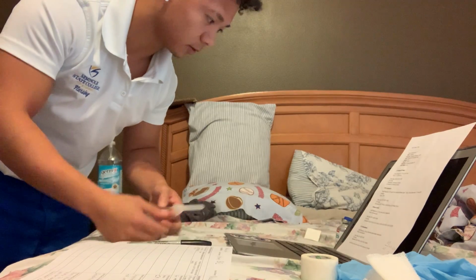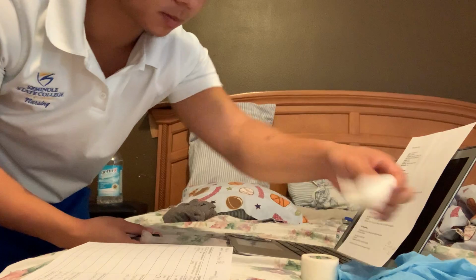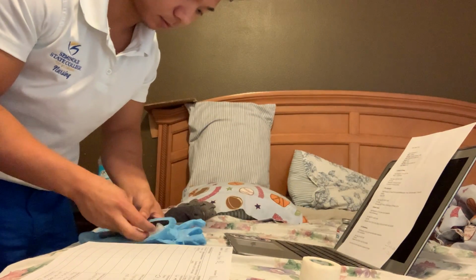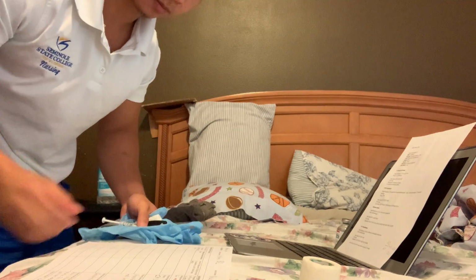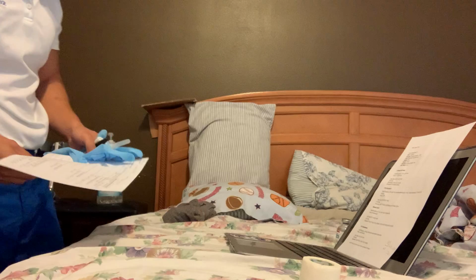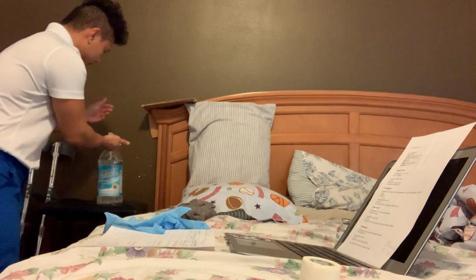So first thing I'm gonna do is assemble all necessary equipment. Once I've assembled all necessary equipment, I'm going to foam in. So I'm gonna sanitize my hands right here.